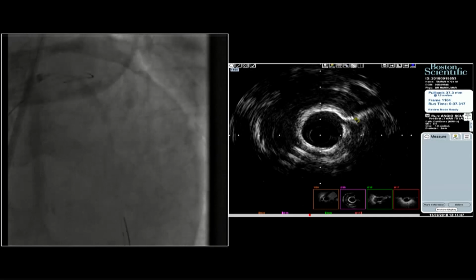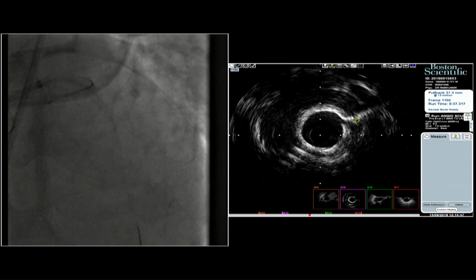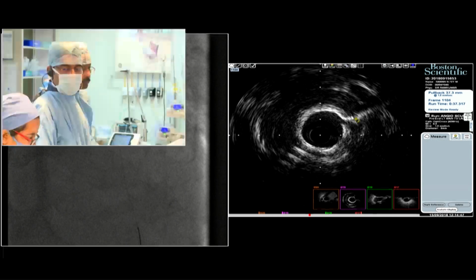So we're going to put an Onyx down and we are going to select the size. Vijay, what do you think should be the distal length of the stent? We are planning to take a little longer stent distally. So we are planning to put a 2.25 by 34 distally. Then you select the proximal stent depending on the remaining length.